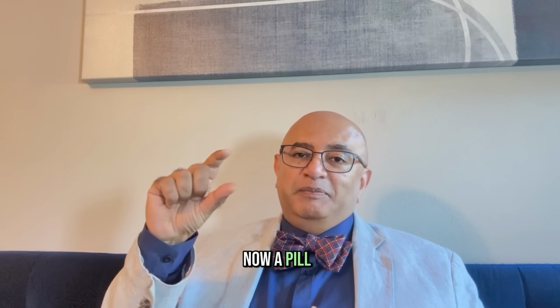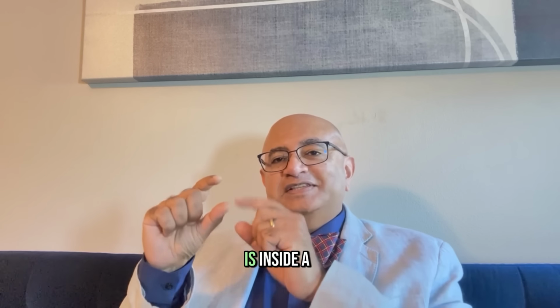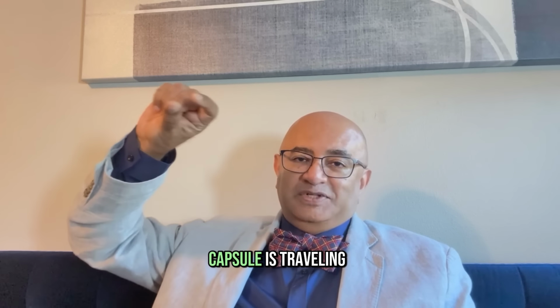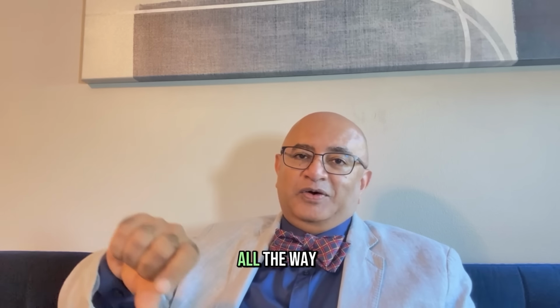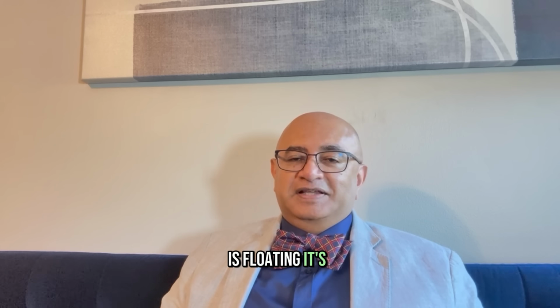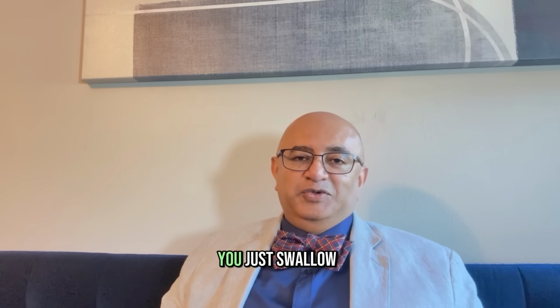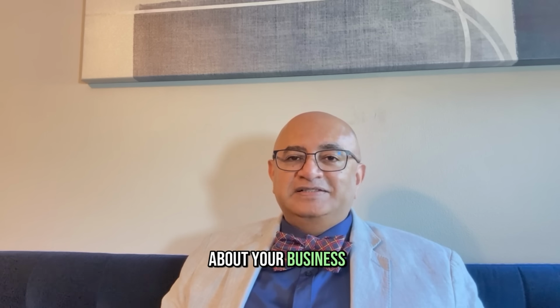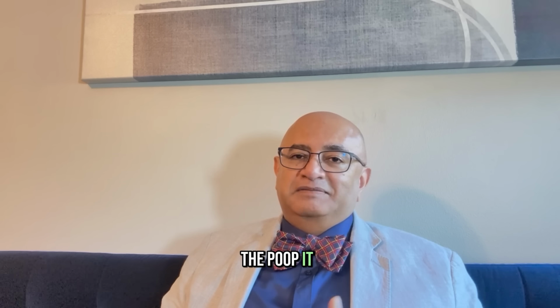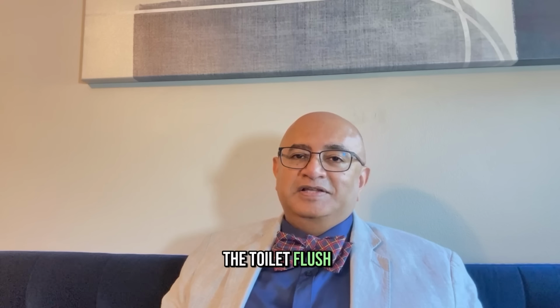So we have now a pill cam, a camera which is inside a capsule that you just swallow. And as the capsule is traveling down your gut all the way, it is taking thousands and thousands and thousands of pictures. It is floating. It's a real live thing. You just swallow and you go about your business and poop it out. And you don't have to return the capsule. The poop takes care of it, the toilet flush, and it's gone.